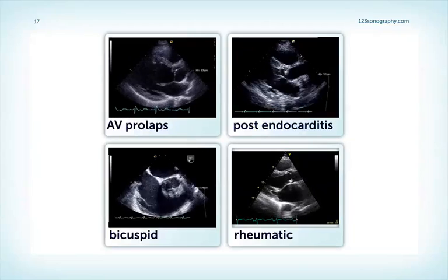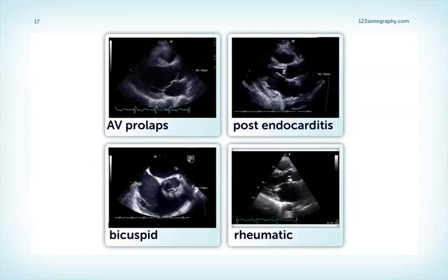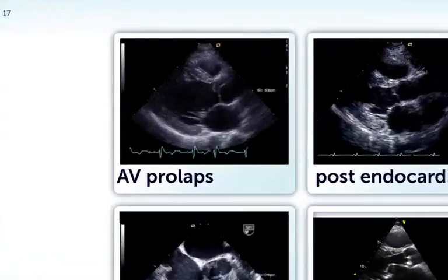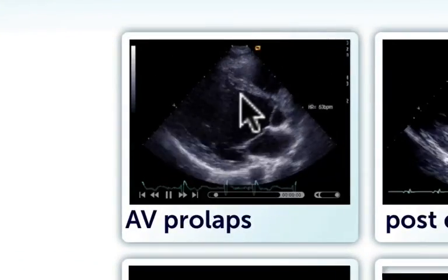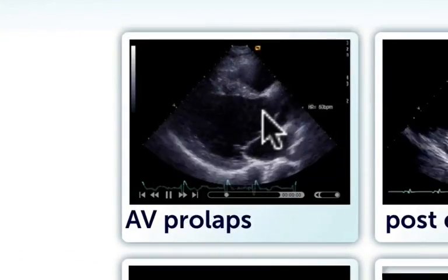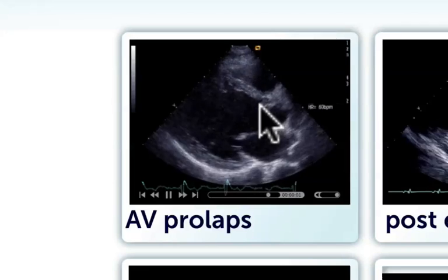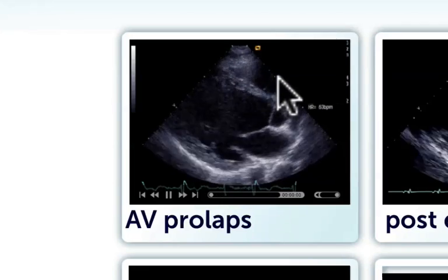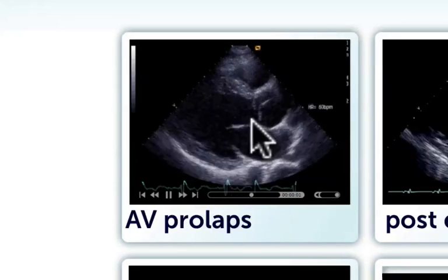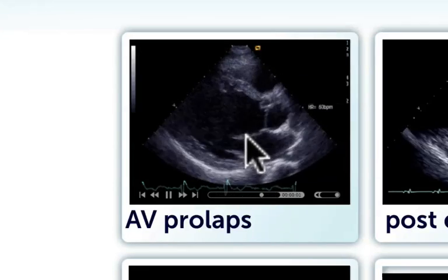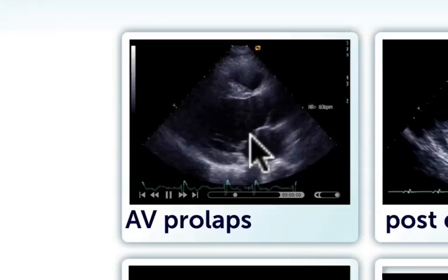Let's take a look at a few patients who have aortic regurgitation. This patient here on the top has a prolapse of the right coronary cusp. These patients often have a very eccentric jet which is pointed towards the anterior mitral valve leaflet.